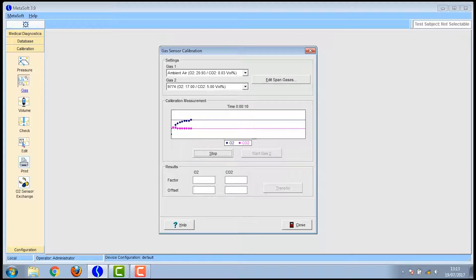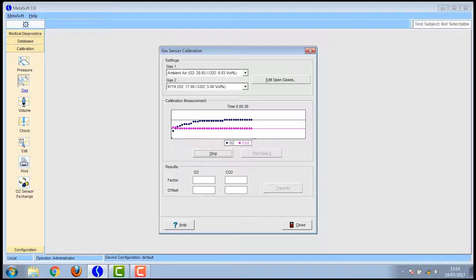Once they produce a straight line for a certain period of time the metabolizer accepts the calibration and allows you to move on to gas 2.